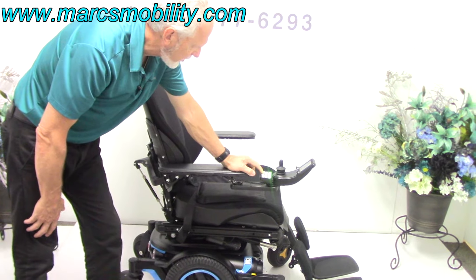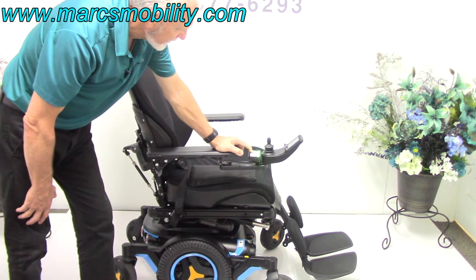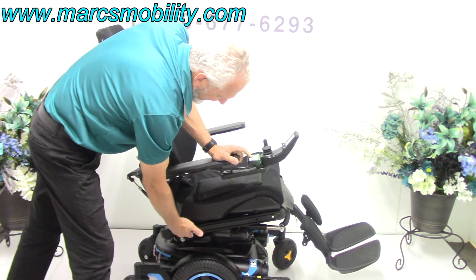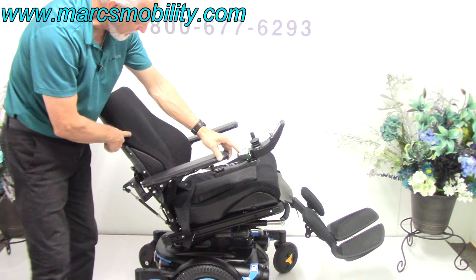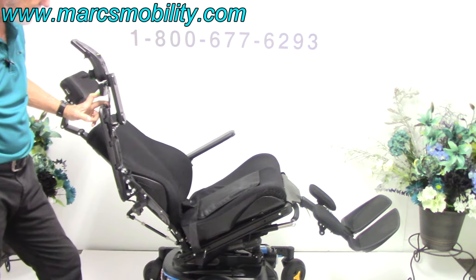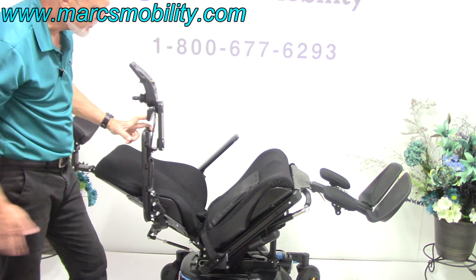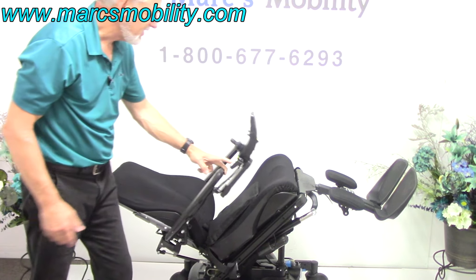The next function is called the electric tilt. The electric tilt is when the bottom of the seat goes back, taking the legs and back of the chair with it. A lot of people like this if they want to take pressure off their seat or if they need improved circulation.